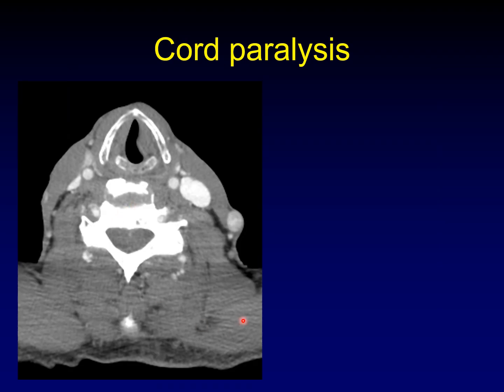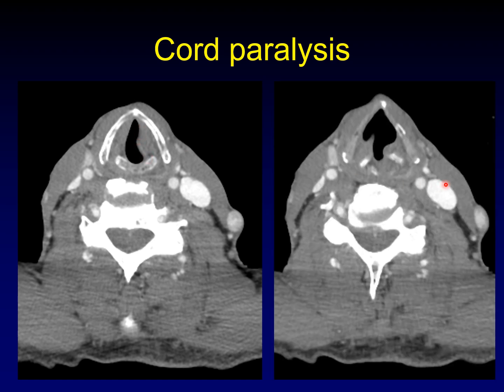Vocal cord paralysis is an important secondary sign — medialization of a cord suggests cord paralysis. You've got to double-check that it is truly medialization of the arytenoid cartilage, not just the vocalis muscle. You've got to see that the arytenoid cartilage has fallen in medially — it's not perched out laterally as on the contralateral side. It's fallen in, pulling the true vocal cord along with it. You can also see that this vocal cord has already started to atrophy, so this isn't an acute paralysis.